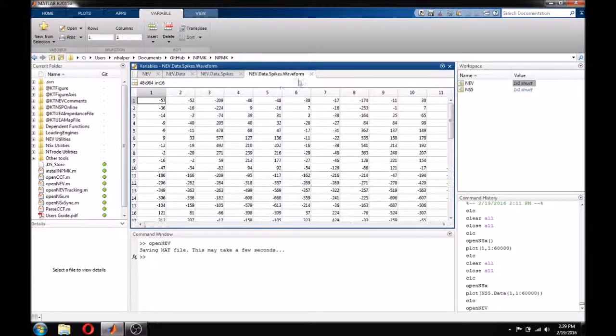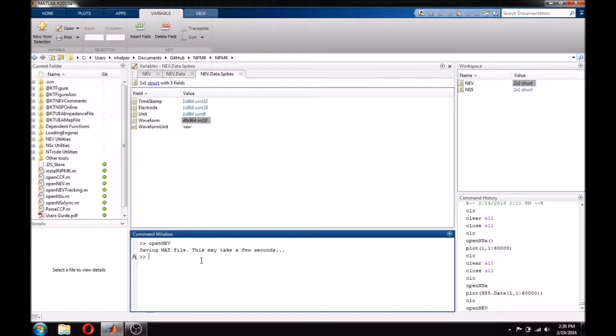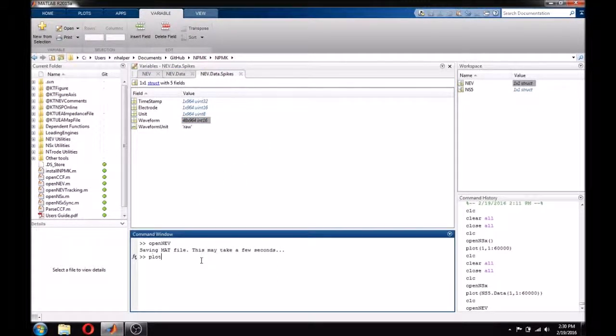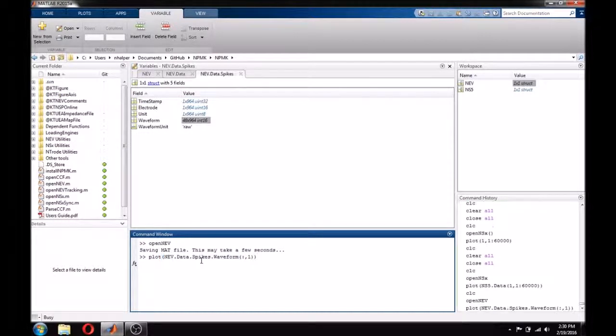To plot this waveform, I can simply type plot nev.data.spikes.waveform and look just at the first column. And now we can see a nice spike waveform.